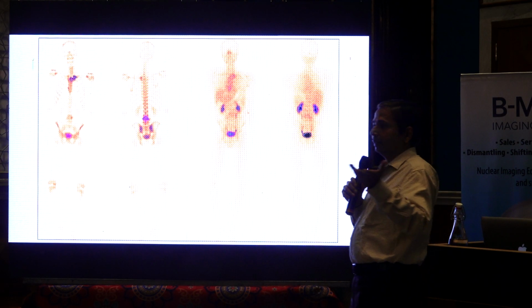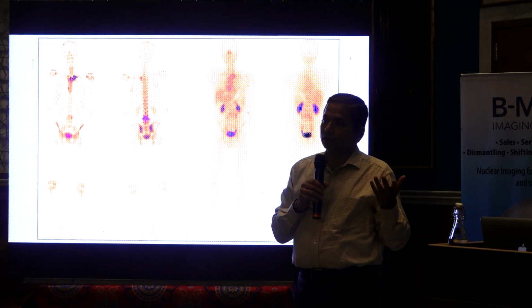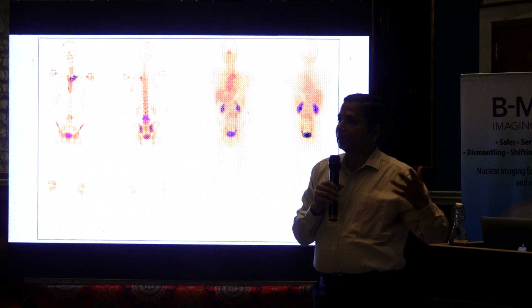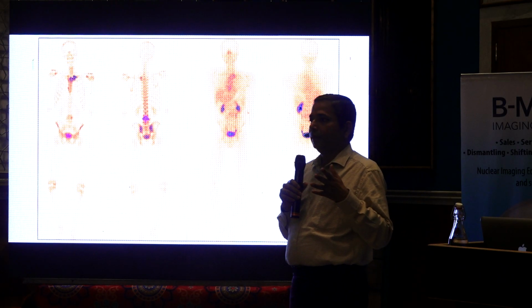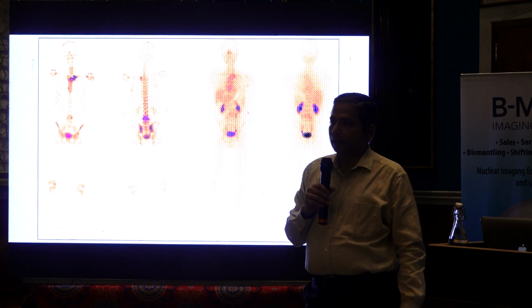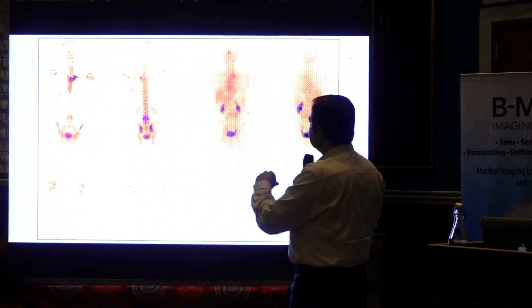Another very common indication is when the patient presents with spondyloarthropathy, spondylodiscitis. The patient presents with back pain, they get an MR done. MR will show some uptake in the end plates of the vertebrae. But what is that? Whether it is metastatic, whether it is infective, whether it is osteoporosis related. For that, bone scan plays a very important role.